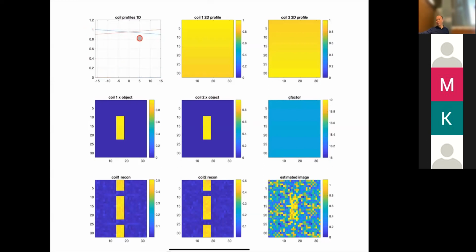Okay, so what this means is now the RF designers actually have to take this into account. In the old days, if you were an RF designer, you would just say, okay, I want to design a coil that has really nice homogeneity, gives me nice electrical properties. Now the coil designers actually have to take into account the reconstruction. Okay, they have to say, well, how would this coil work with the reconstruction? Because obviously, if I design a coil like this and gave it to my manager, and these are the images that come out, they would say, well, this coil sucks, right? Go design a better coil. All right. So now you're seeing the construction of the hardware depends on the recon. So there's this interplay between the two. Okay.